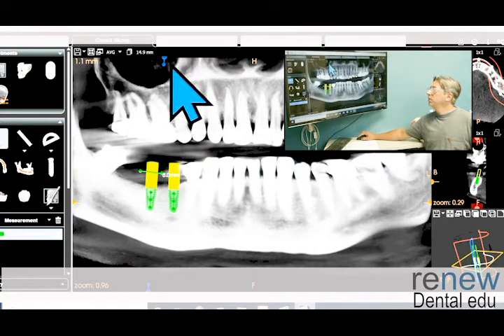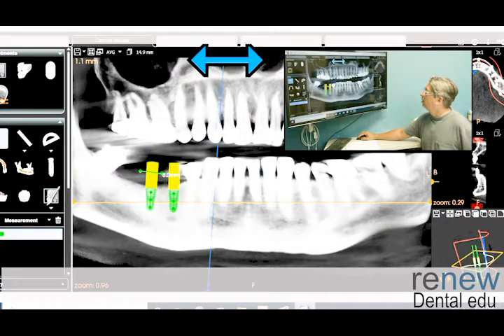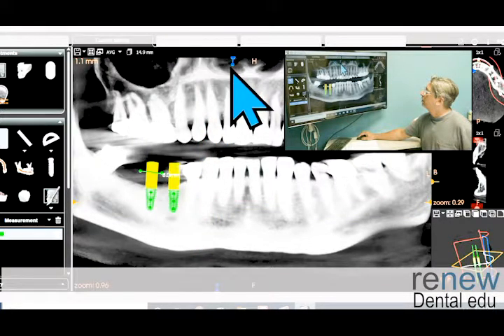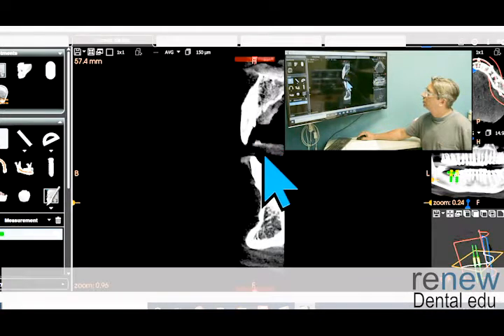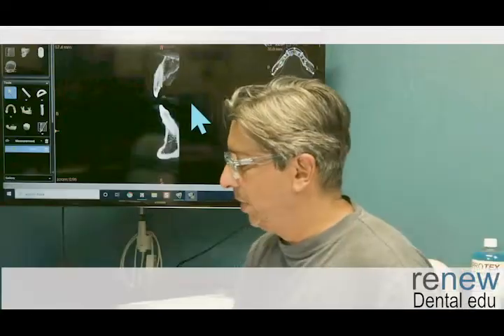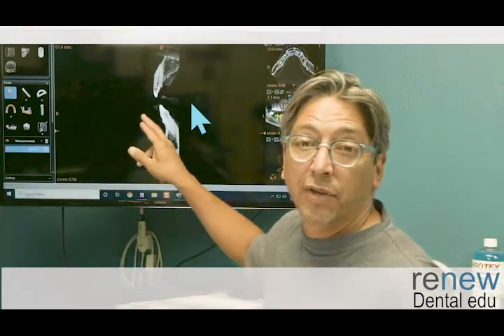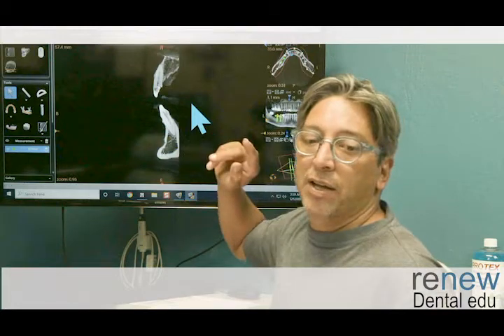I like the case. If you look at the uppers, there's a little interesting thing on the angulation of those teeth in the upper. Let me get to this central lateral. So looking at that angulation, once again, this is a nice element here that we have this facial bone sticking out here, or even on the lowers here. But the way these are angled in, you're going to really have to angle that implant into this bone if you did an immediate placement. And that's not a bad scenario for an immediate placement situation as well. If you're looking at a starter case to do, this is not so bad. But anyway, that's pretty straightforward.